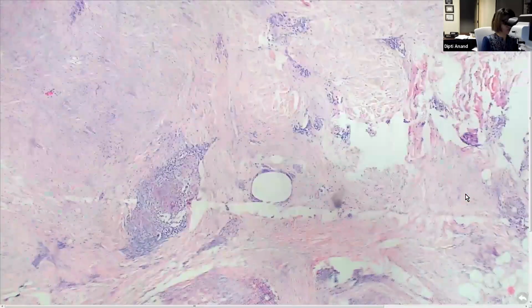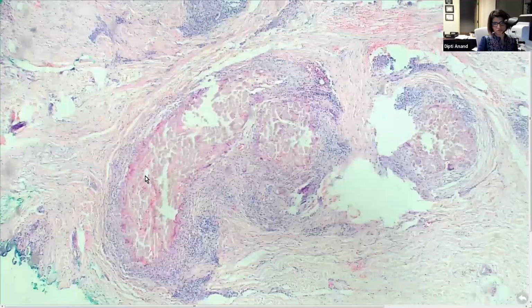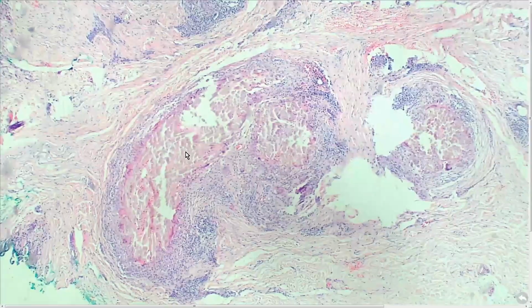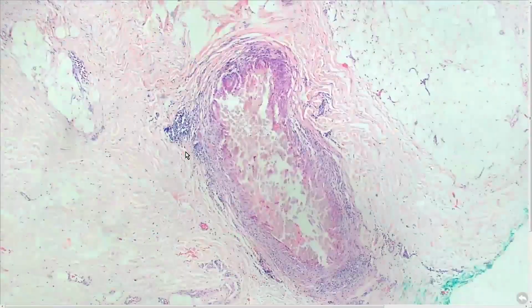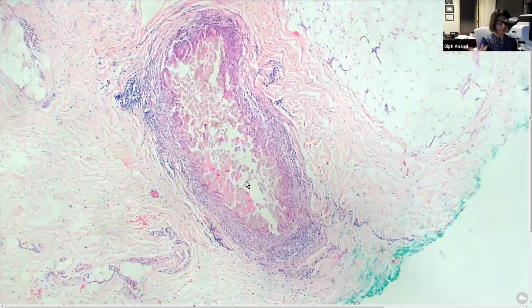This again is all for next time, but they are easy slides because once you know that you have seen it, you'll remember. So there's a scar, and then what do you see in here? Is that suture? Yep, it's suture. We'll see different kinds of suture next time, but this is suture granuloma. Good. And you have your slide number 15.